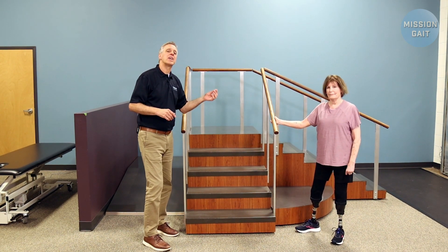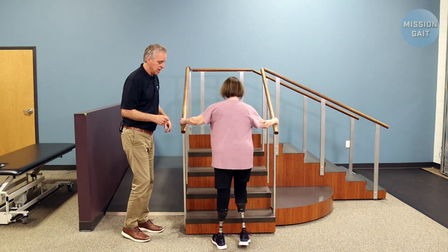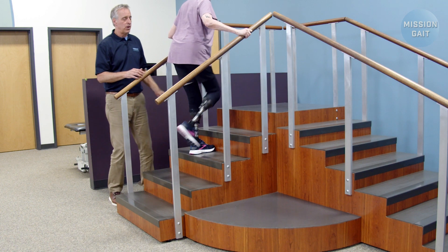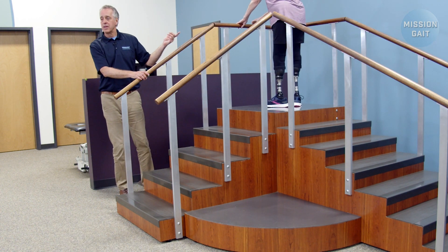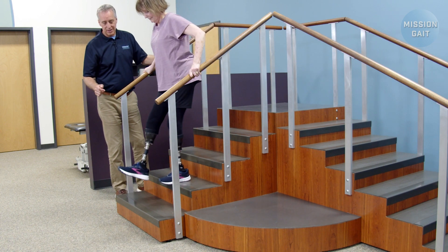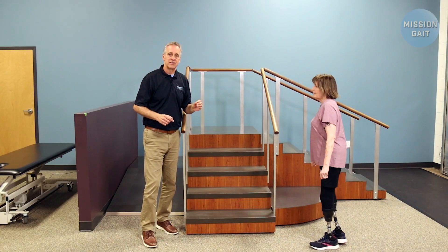In this one we're going to let Stephanie do what she can do at home using the rail, but leg over leg. As you gain confidence, you come up. She's going to bring her foot all the way solid, step all the way to the next step, keeping lean forward to be strong — lean forward to be strong — all the way up the step. Coming down, same thing. If she has both railings, she seals the toes — hangs the toes a little bit off the end — which gives her the ability to get that knee to bend a little bit easier with a little bit less back pressure, and yet she's very stable up and down the steps.